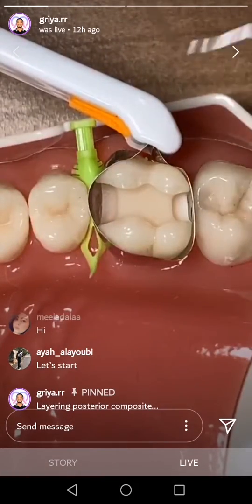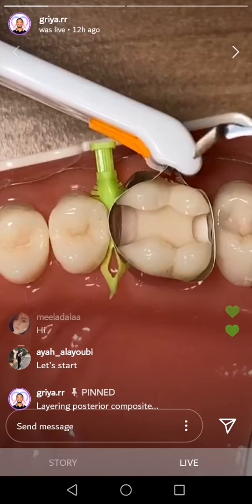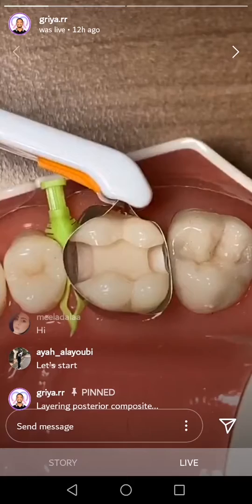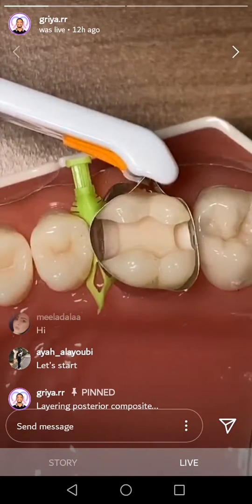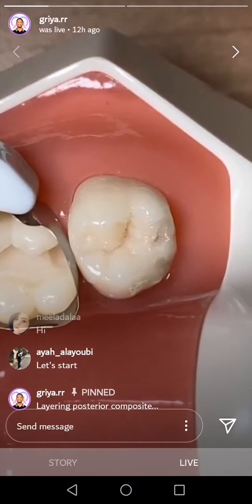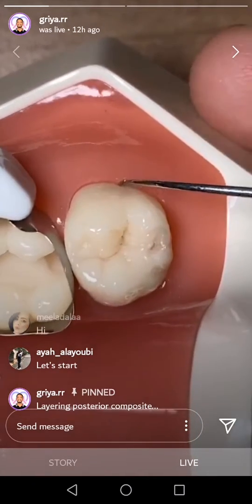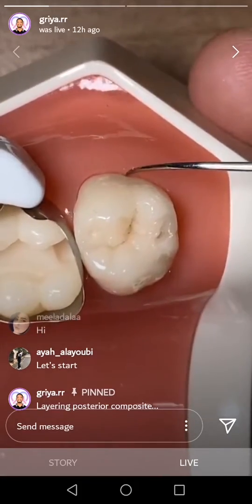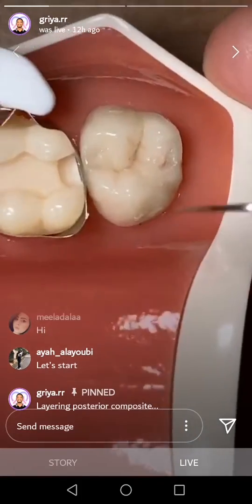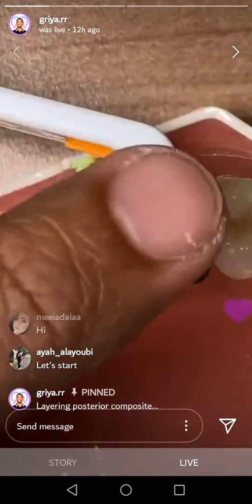Also for me, I always do class 2 with local injection, local anesthesia I mean. So I will anesthetize. For example, I will do infiltration in here, buccal infiltration in here, and then palatal in here. And then you can do the restoration under local anesthesia.